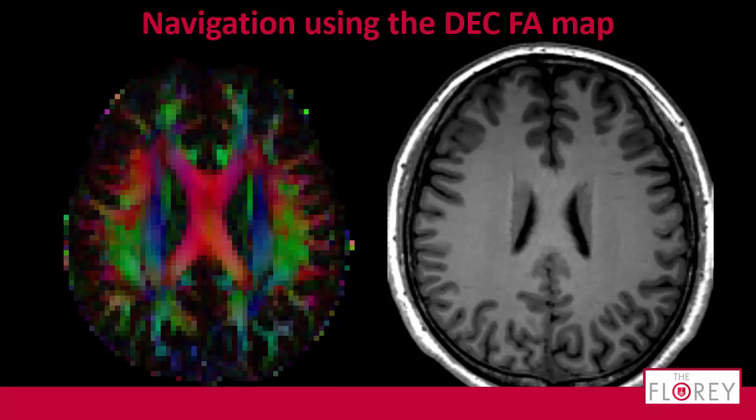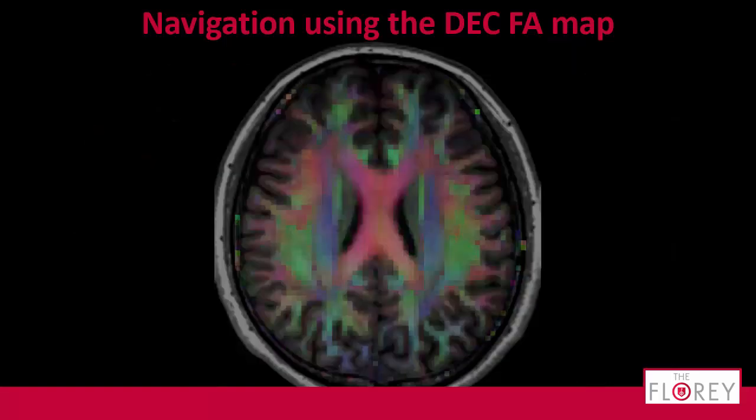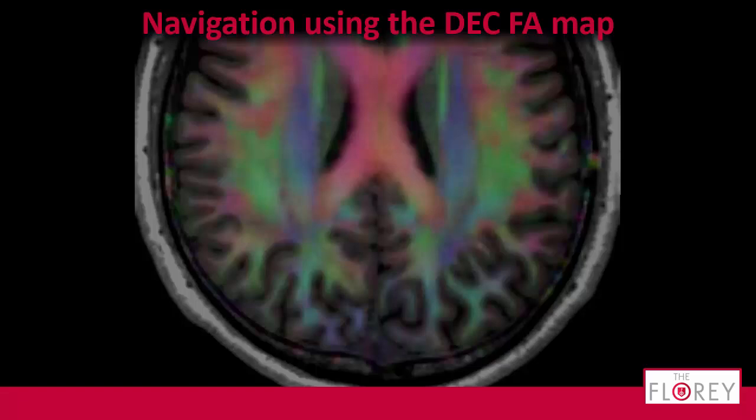So, done with the boxes. Let's be a bit clever now. Just overlay the thing with transparency. In that way, we're not going to be messed up by switching back and forth. So it almost seems as if the colors are extrapolating, because we have some help. Maybe we can also interpolate the DEC FA. It's even better. Looks quite nice. Let's zoom in. It's quite good.